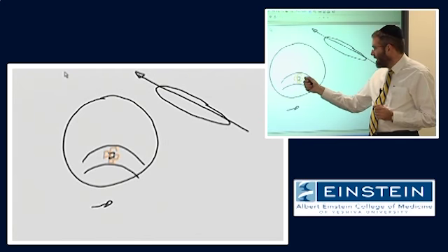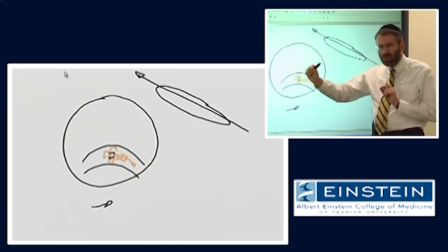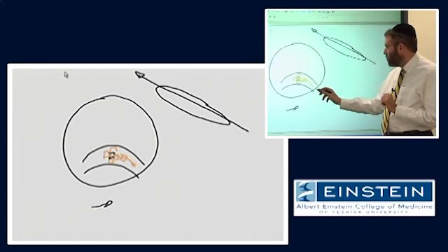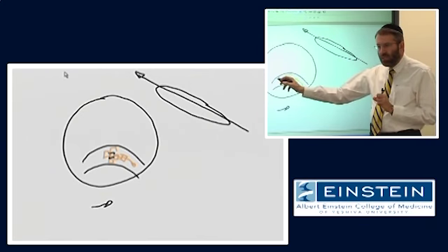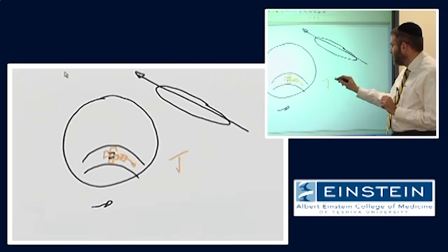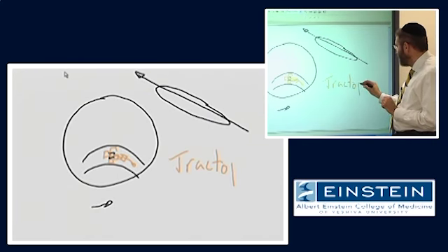And make that go in a stepwise fashion, find that across some trajectory there would be a continuous pathway of this principal diffusion direction. And that allows us to reconstruct the location and orientation of diffusion, doing what we refer to as diffusion fiber tractography.